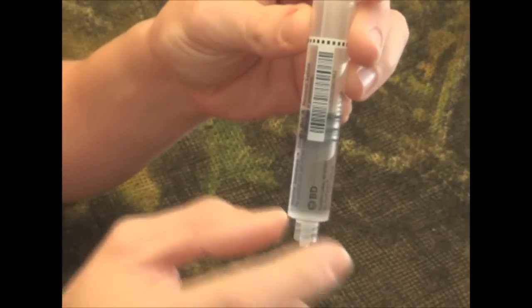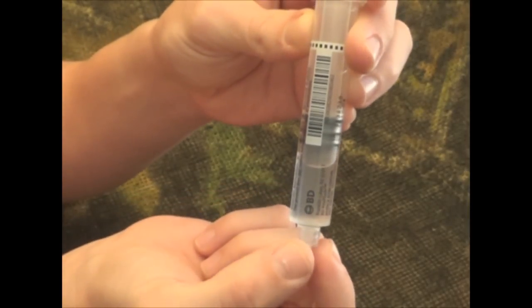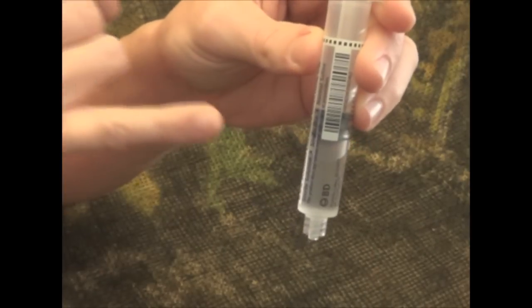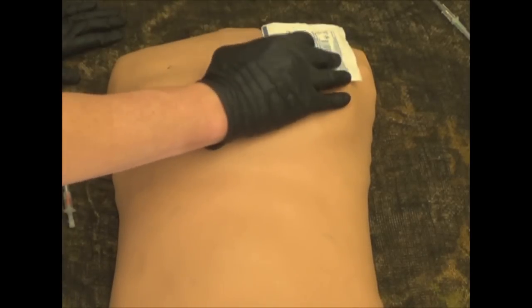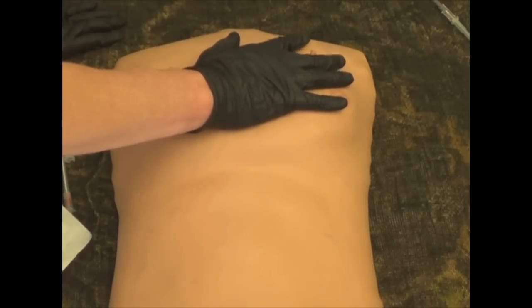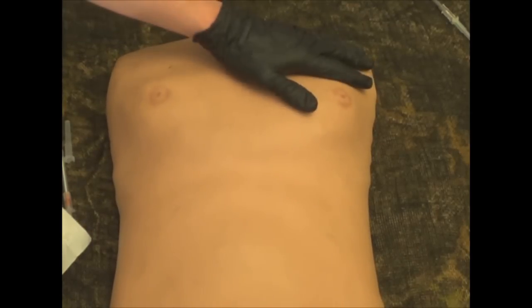Another trick is to fill your syringe with about 5 cc's of normal saline, attach it to the end of your hub on the needle you're going to use to decompress, and as you enter the chest cavity, you'll see air bubbles coming up. Typically we do not cover this anymore — we don't put a bandage taped on three sides anymore. We just leave it the way it is. That's something that's changing in the pre-hospital setting, so you don't have to cover this up; you can leave it and let the air burp itself out.